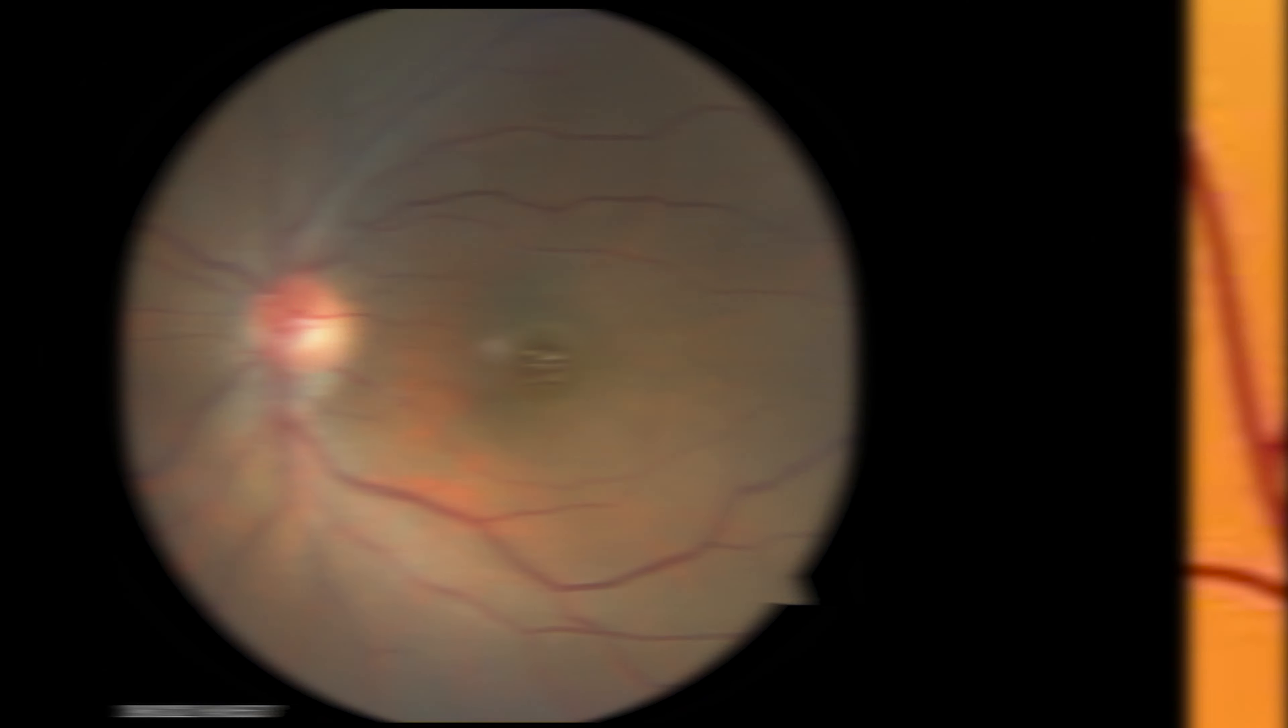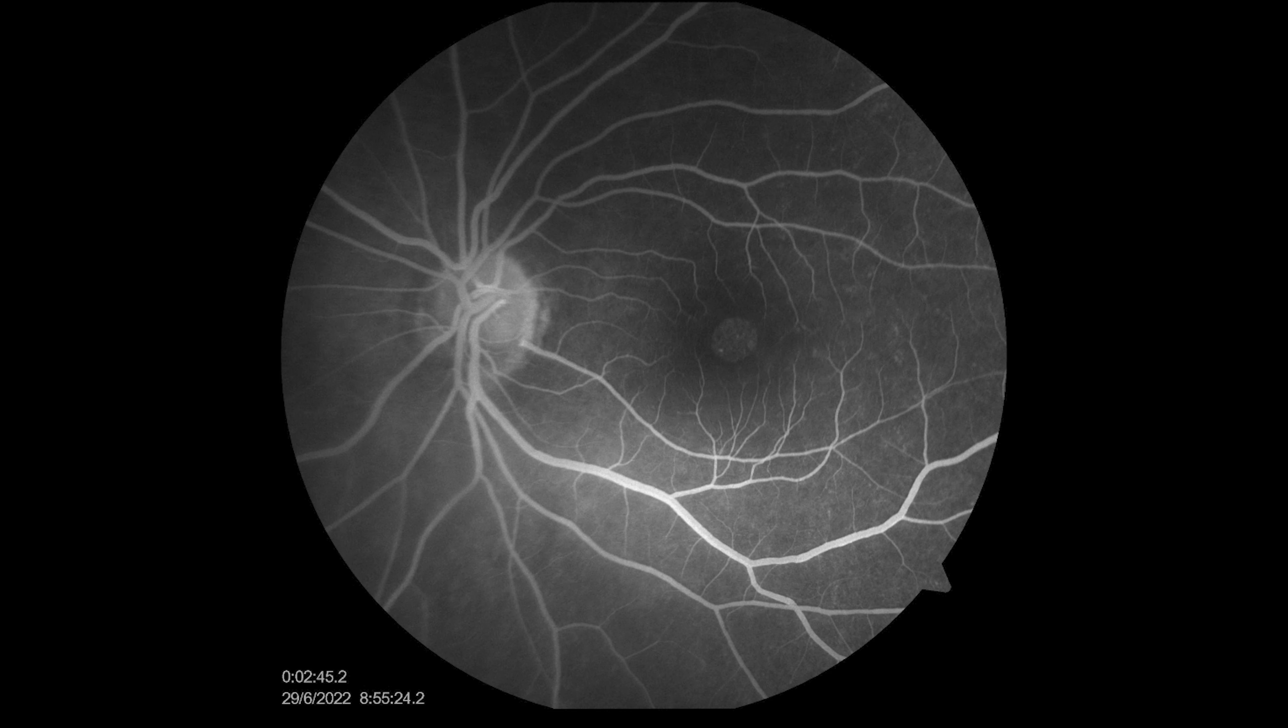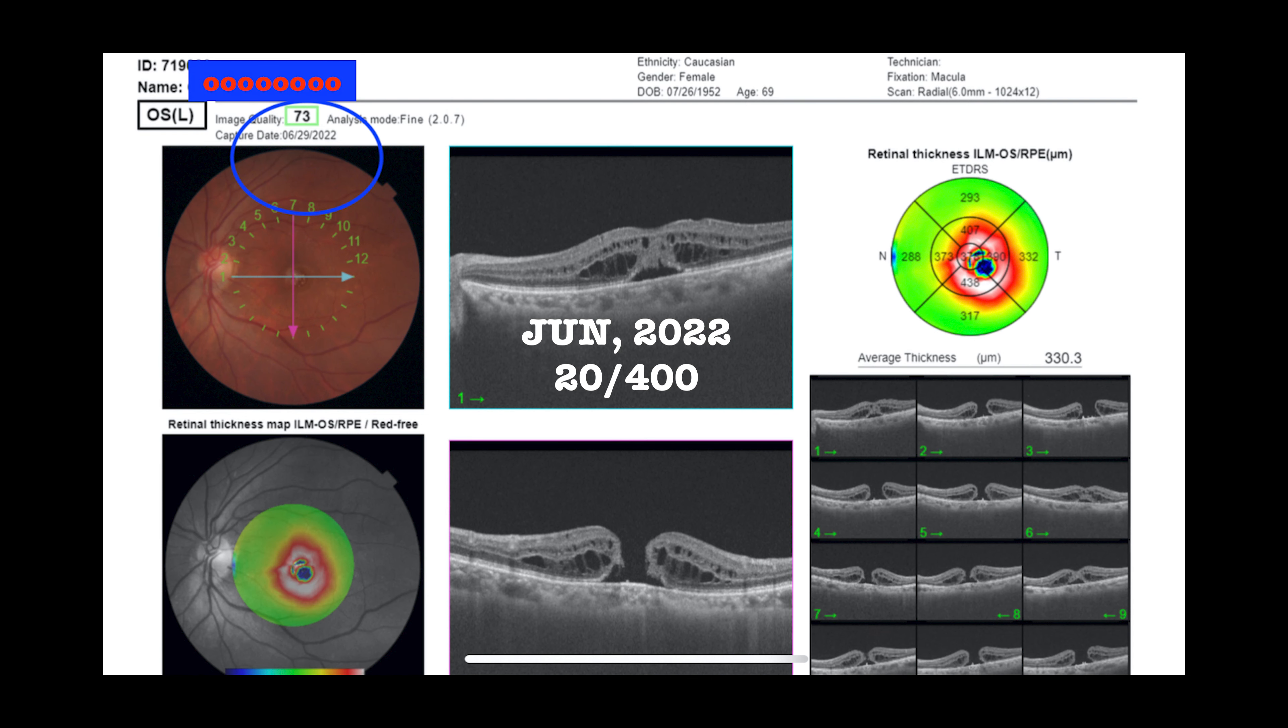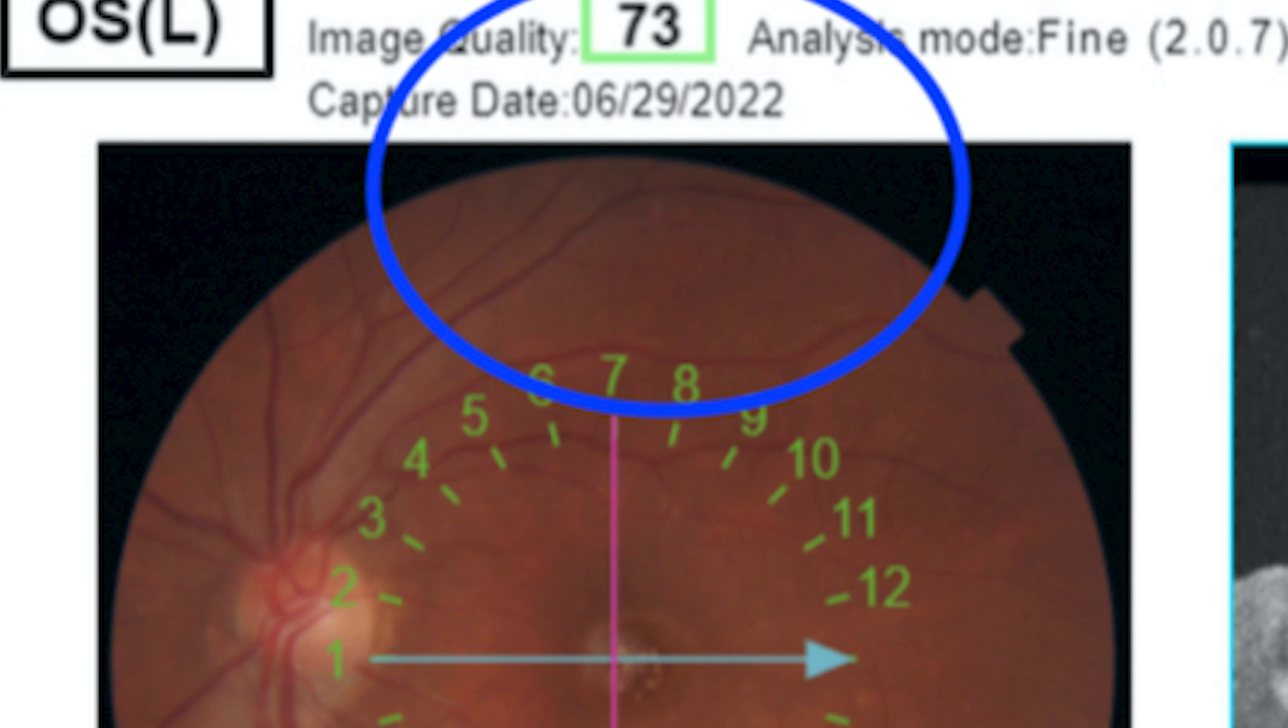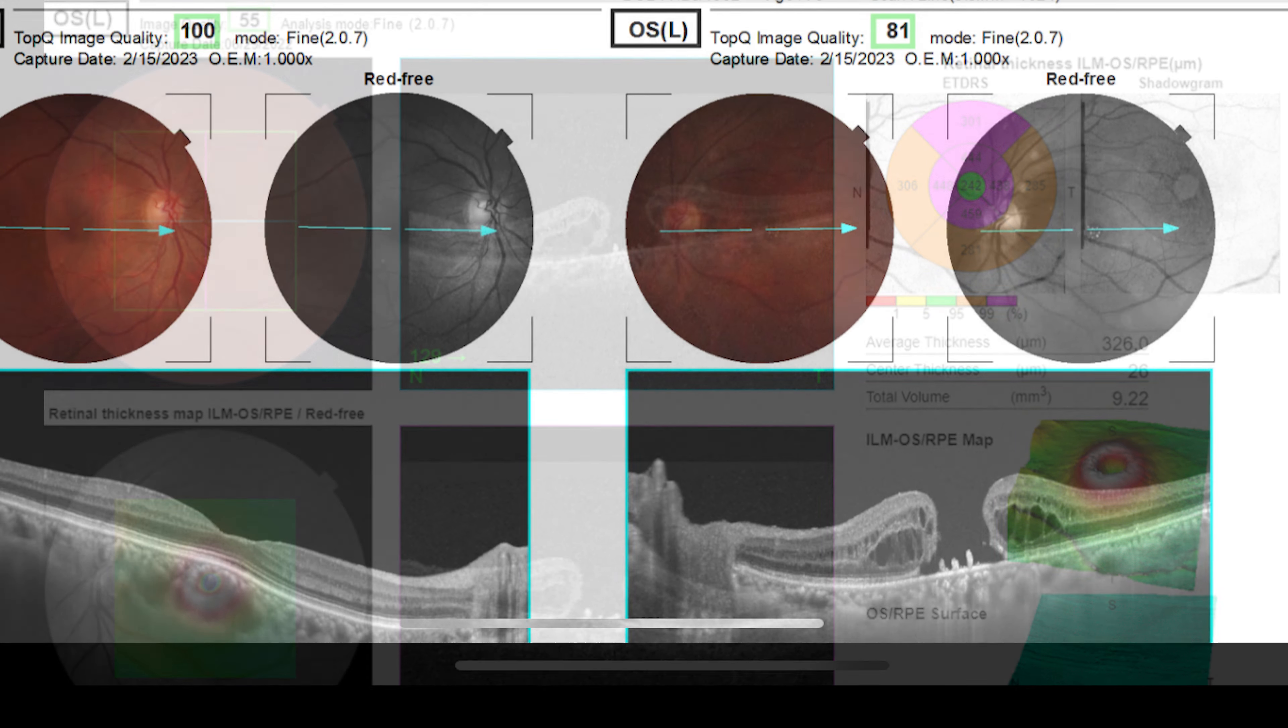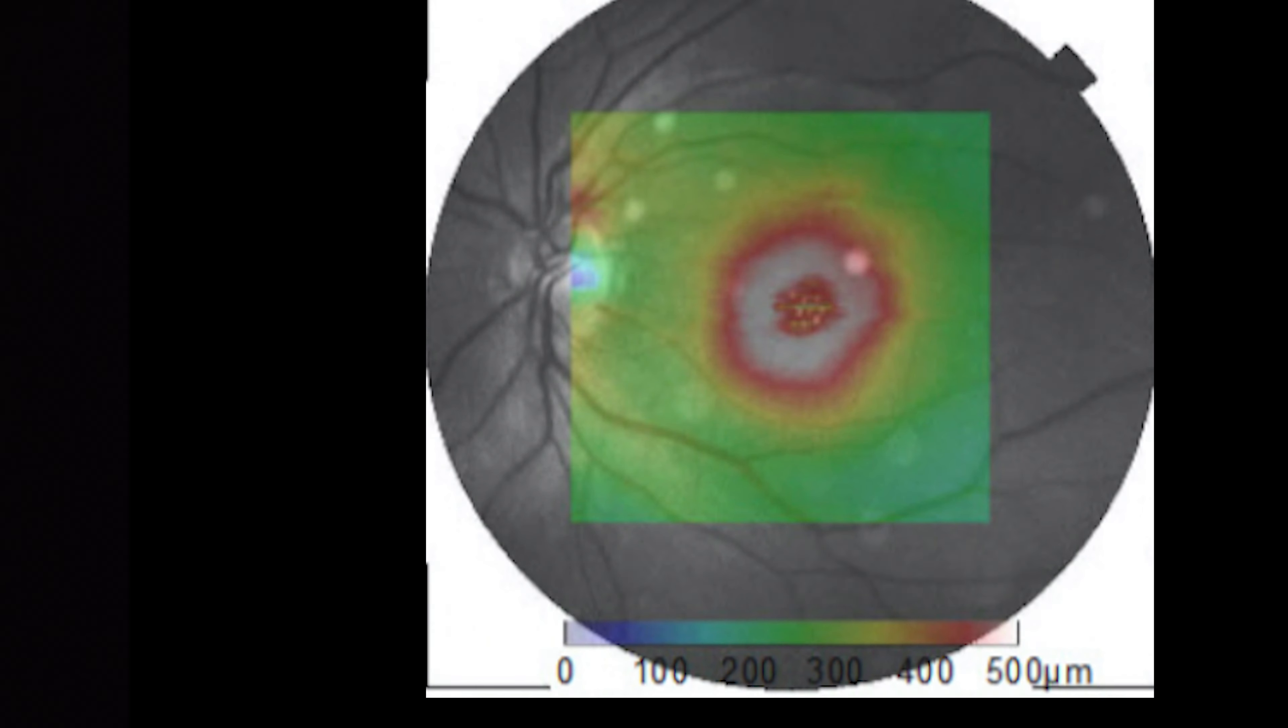These are color FA picks and preoperative OCTs from the patient. Different views can show a full thickness macular hole, a large one. It measures 640 microns. The first OCT was performed in mid-June 2022 and another one repeated February 2023. The patient was really reluctant to have surgery all this time.